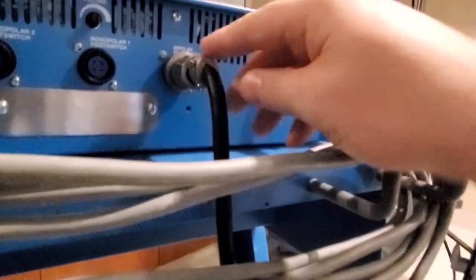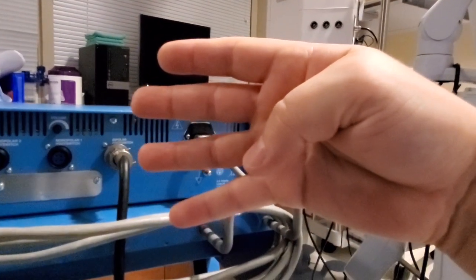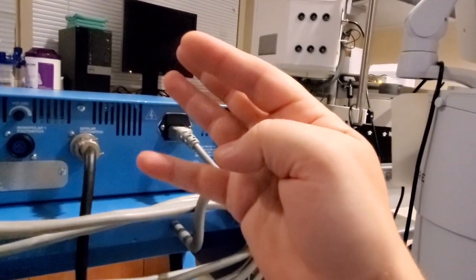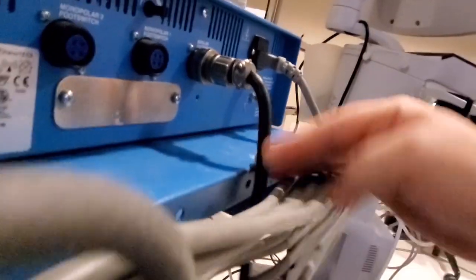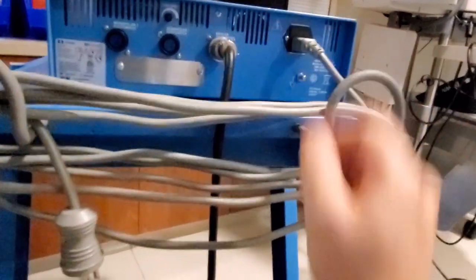You can see how this cable here is being pulled at a direct angle. If you can imagine a bunch of conductors and now you yank it down at an angle, certain conductors are being stretched while other ones are being compressed. And that's what's going on when this type of situation happens. You can see that it's being yanked just due to the weight of the cable. And that eventually is going to cause breakages and damages up here.